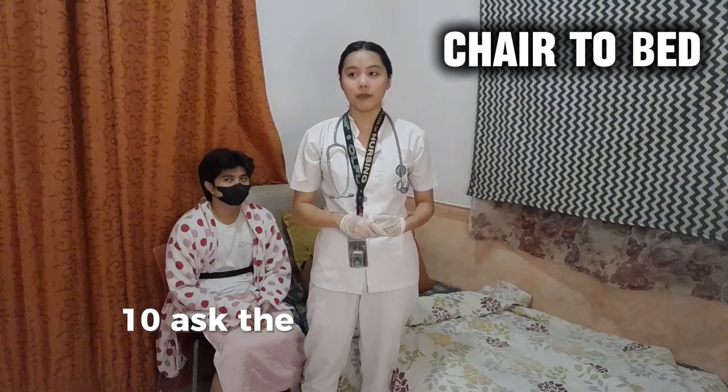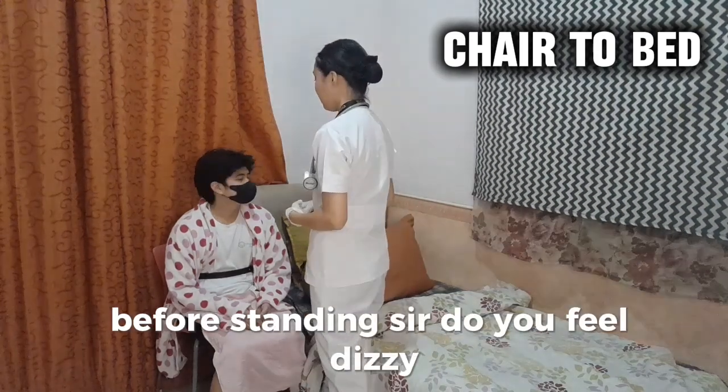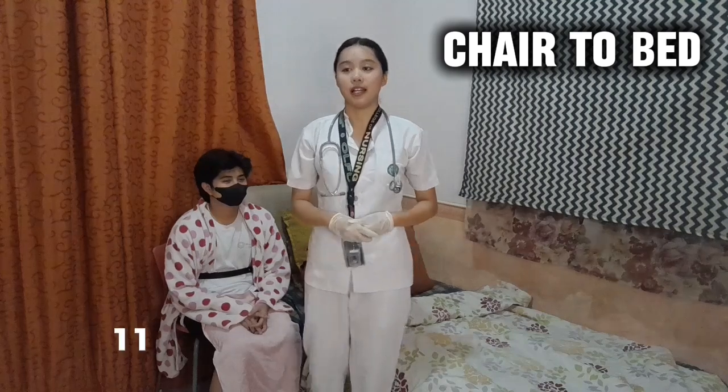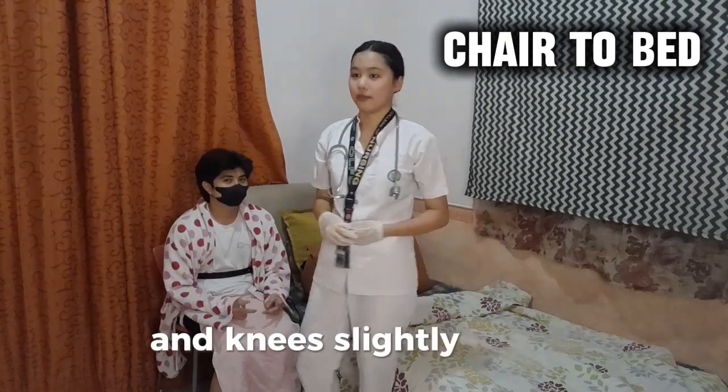10. Ask the patient if they feel dizzy or weak before standing. Sir, do you feel dizzy? Okay. 11. Stand in front of the patient with feet shoulder width apart and knees slightly bent.